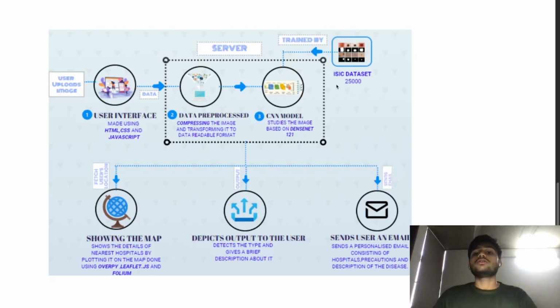Our model is trained on the ISIC dataset, which contains about 25,000 different images of 9 different skin diseases which are termed to be fatal. We do not stop here. We promised an end-to-end telemedicine solution, so we are going to provide it.